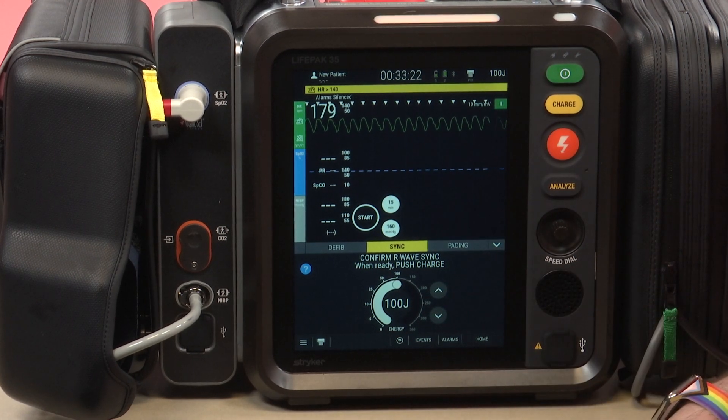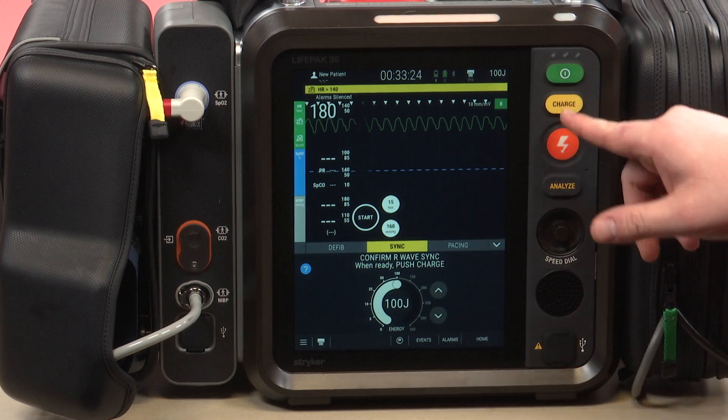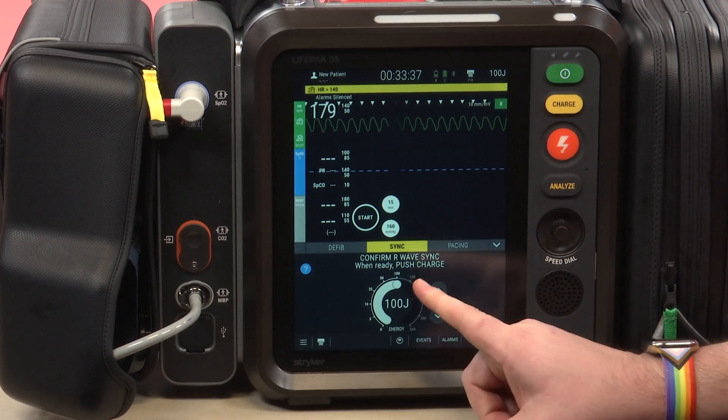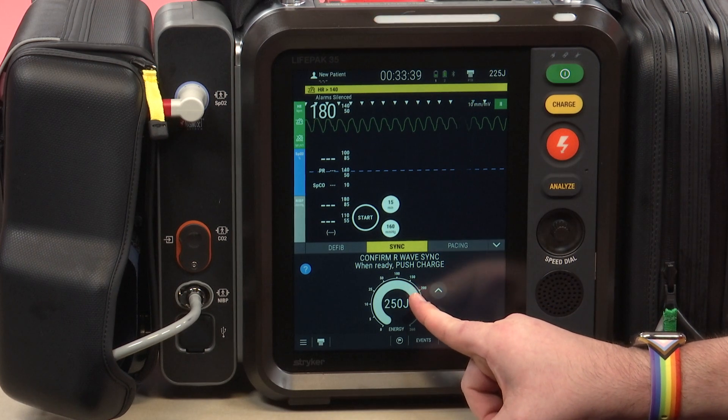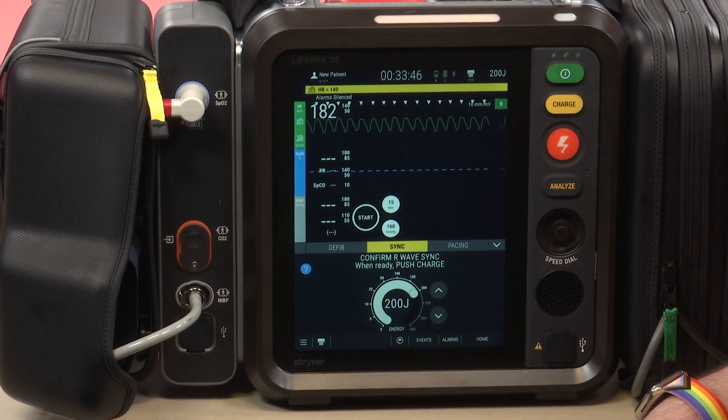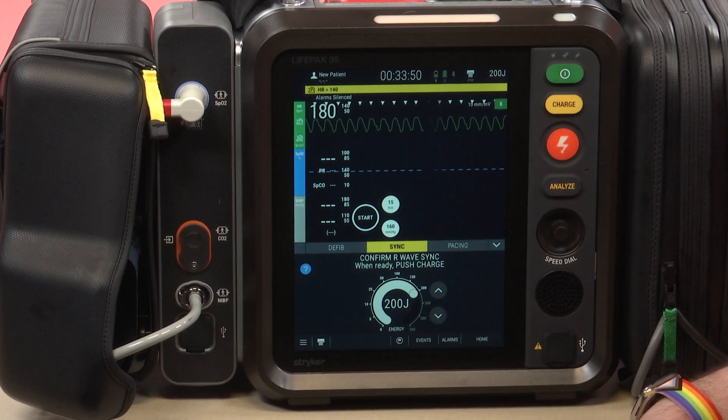From here, what I would do is just charge and shock the patient. Remember, if we have a patient in unstable AFib RVR and we've decided to cardiovert them, AFib we cardiovert initially at 200 joules. So 100 joules for SVT and VTAC, and then 200 joules for AFib RVR — again, these are hemodynamically unstable patients. I would adjust the energy accordingly.